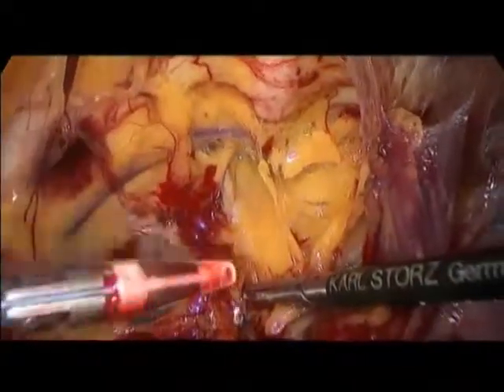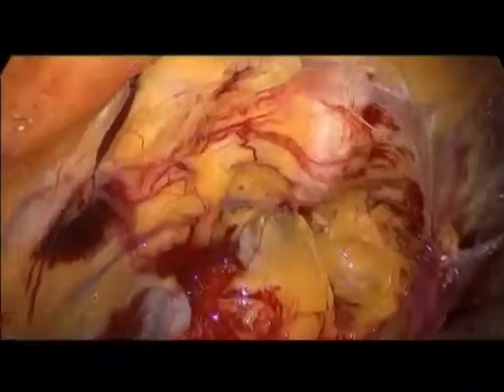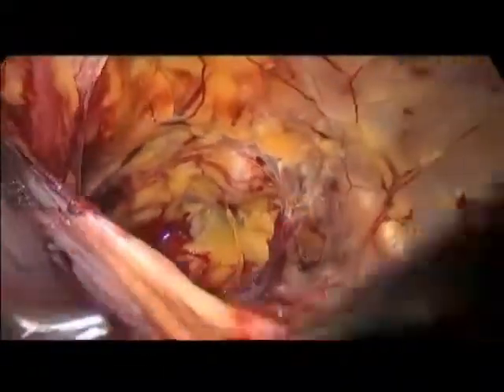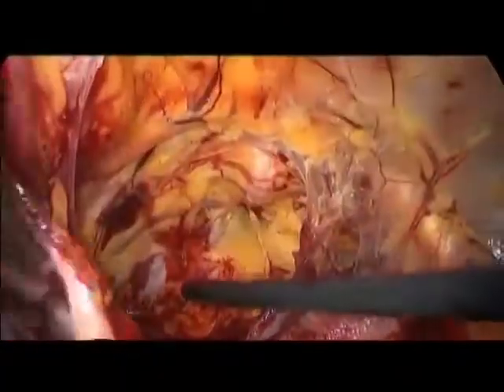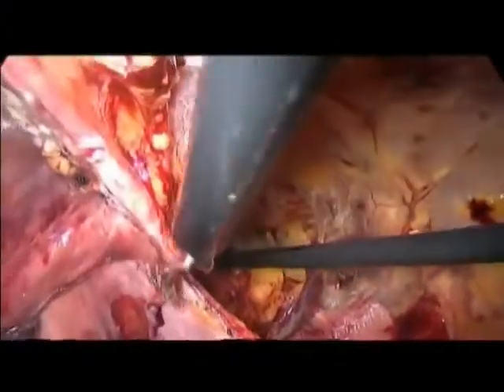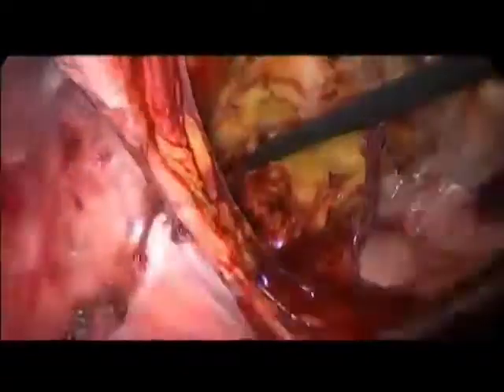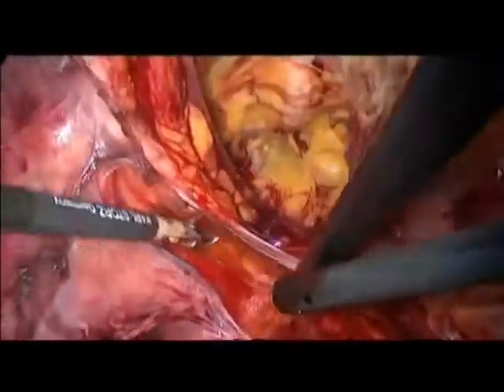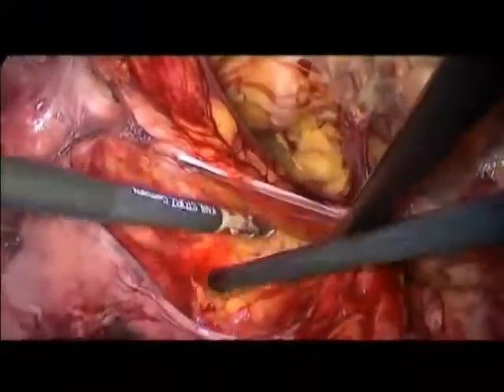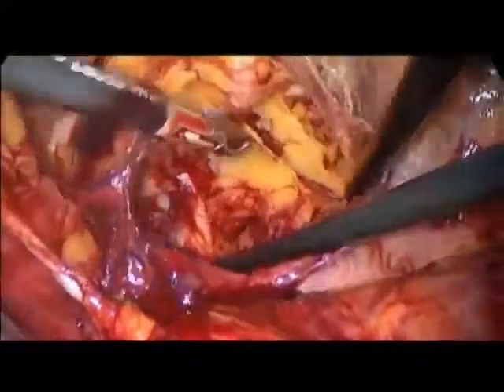I take the bipolar. And I move. And as soon as this flap has been released, I come back with the scissors in the medial trocar and will work from there for all the remaining maneuvers of the procedure. We just need here to develop a little bit the dissection lateral to the bladder to avoid having large curtains in front of the lateral trocars and avoid any misplacement of instruments, but otherwise it's quite simple to develop.